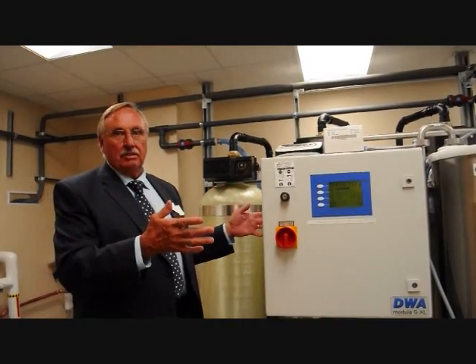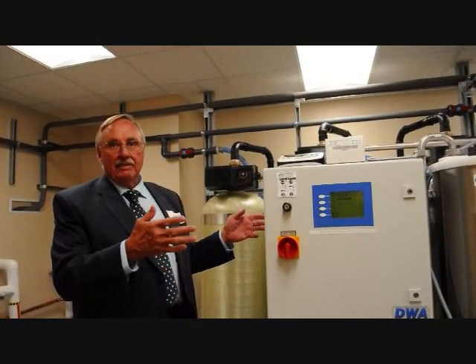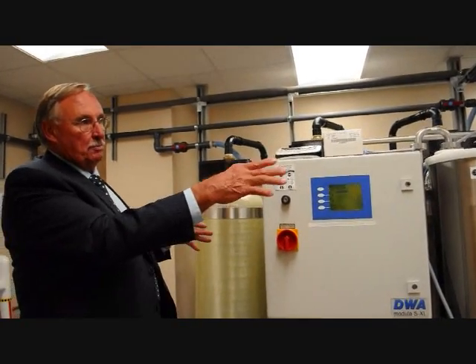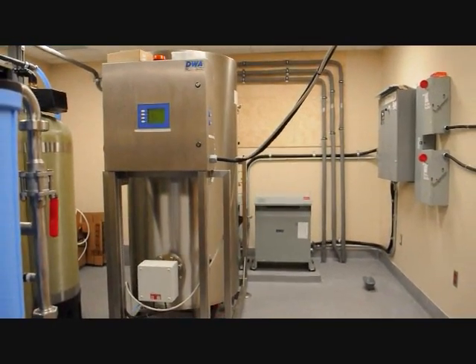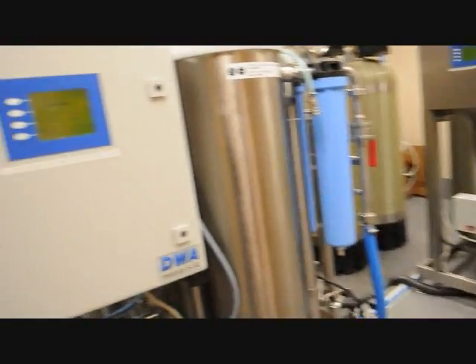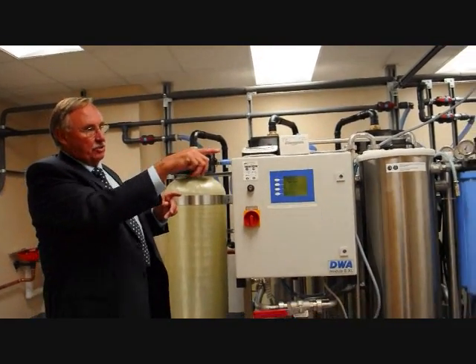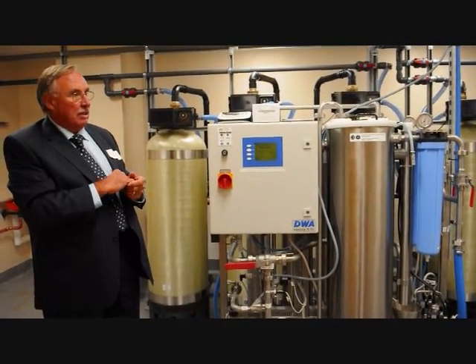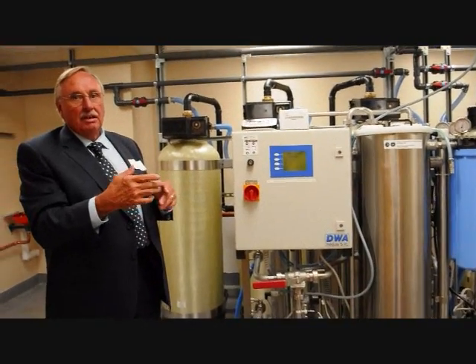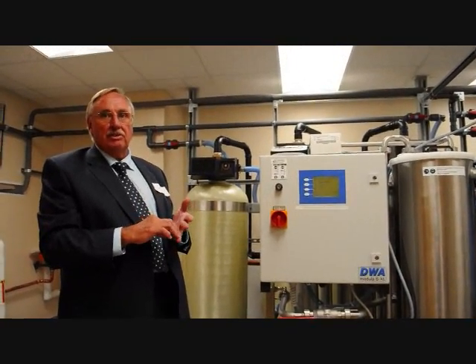So we treat the water down to what would be classified anywhere else as ultra-pure water, and then it is transported from here through a pump on this next skid, and then out to all of the dialysis bed heads, all the way around the dialysis clinic. As it comes back from the last bed head, it goes through another ultrafiltration stage on the other piece of machinery. The ultrafiltration on the other machine maintains that ultra-pure status of having zero bacteria, zero endotoxin all of the time.